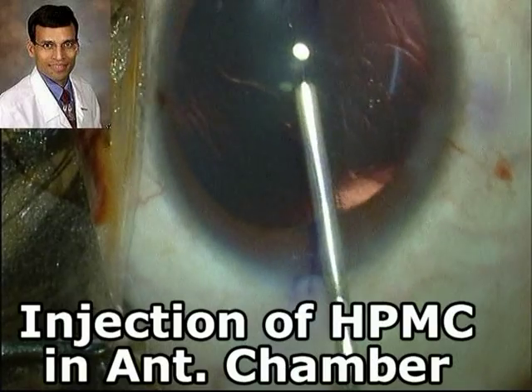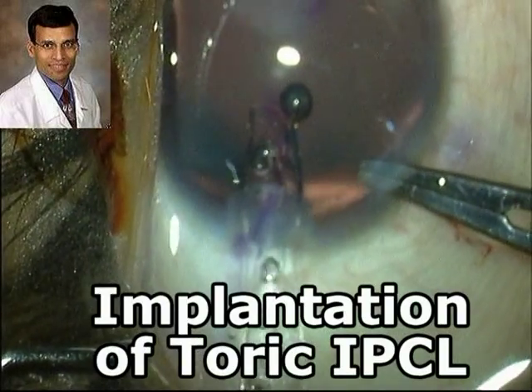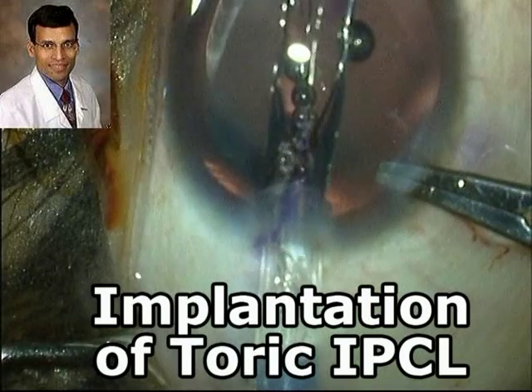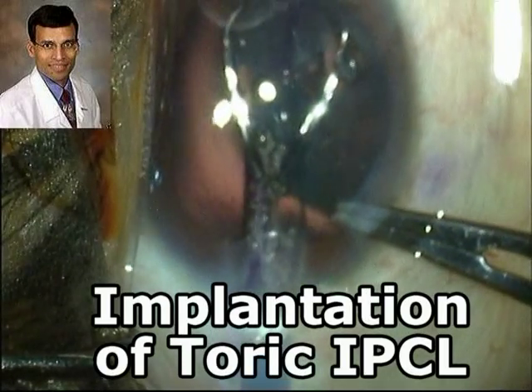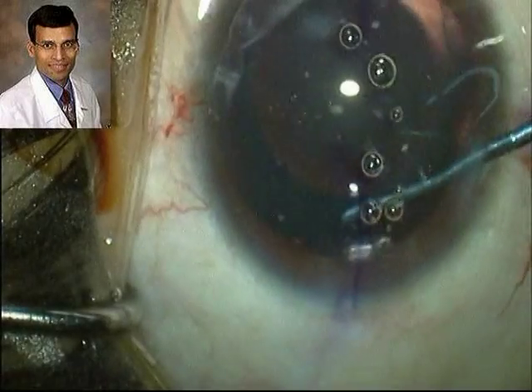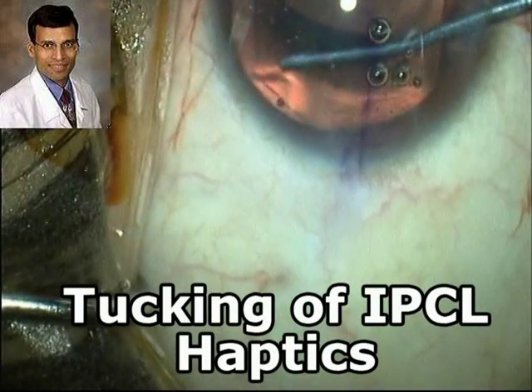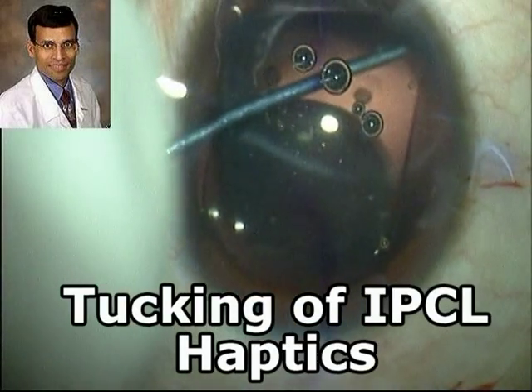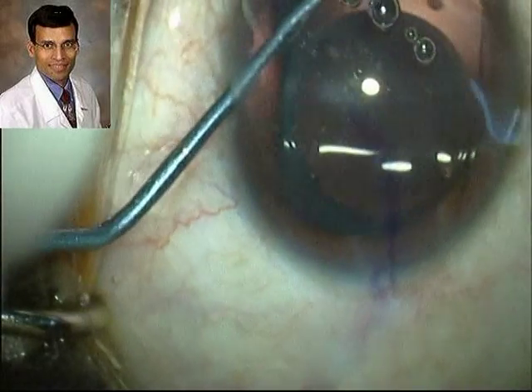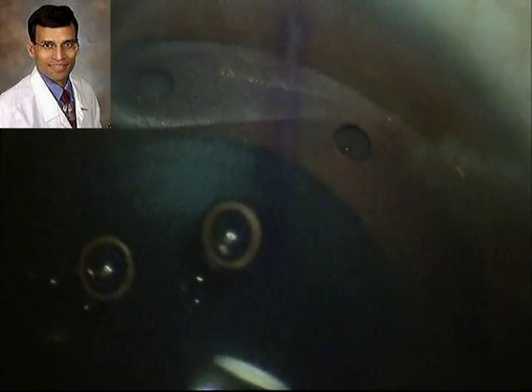We then make the main incision and again inject HPMC into the anterior chamber, taking care not to overfill or underfill and to maintain visible HPMC chains. We then inject the toric IPCL into the anterior chamber, unfolding it carefully to ensure that it unfolds just above the iris. We must take care that the IPCL is not directed posteriorly and does not hit the lens. Once the IPCL has come out of the injector, we ensure it is properly oriented by confirming the mark on the leading haptic is on the left side. Then, using an instrument called the IPCL manipulator, all six small haptics — three on each side — are tucked behind the iris.